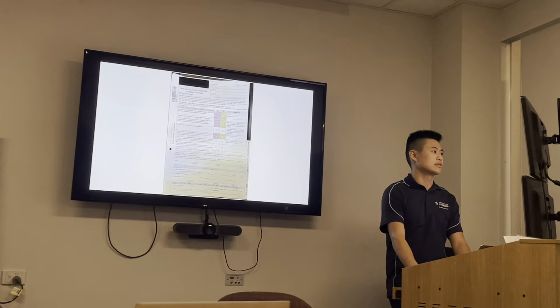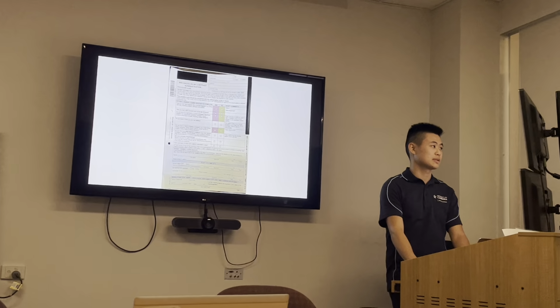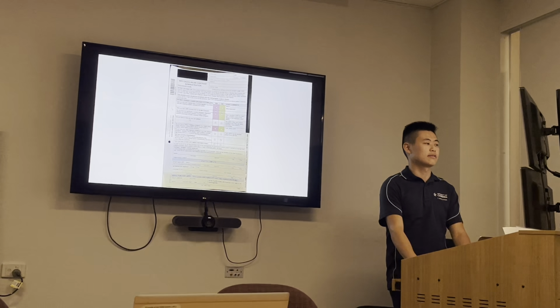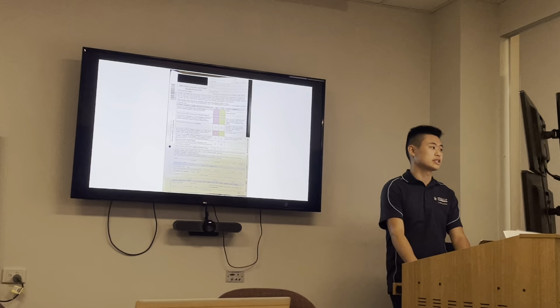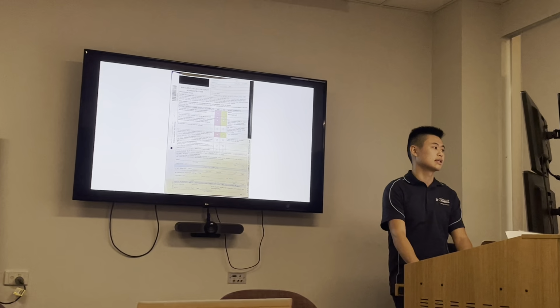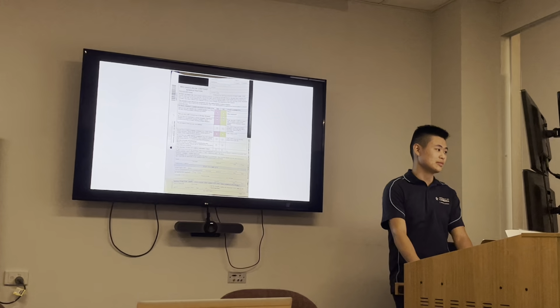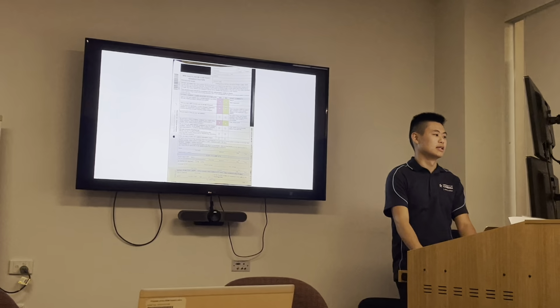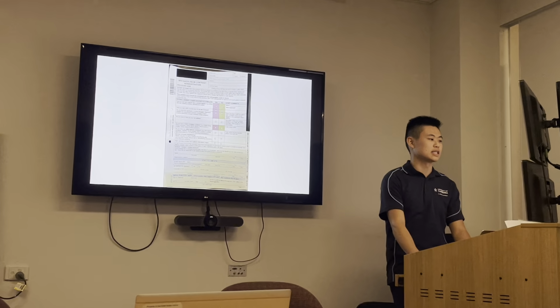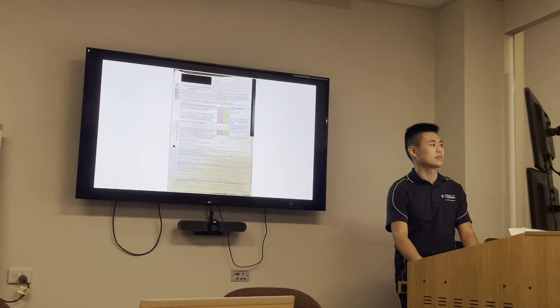So this asks for any contrast injection reactions, previous contrast exams, any allergies, if they ever had asthma, any kidney problems, medical conditions, if they're currently breastfeeding, and the prior information sheet. So then again, they would sign off and staff would sign off on here. It's important to note that eGFR has to be over 30, or else you would have kidney problems.